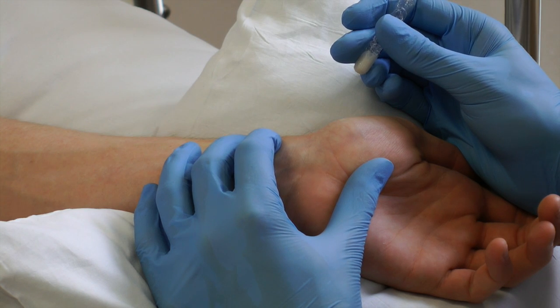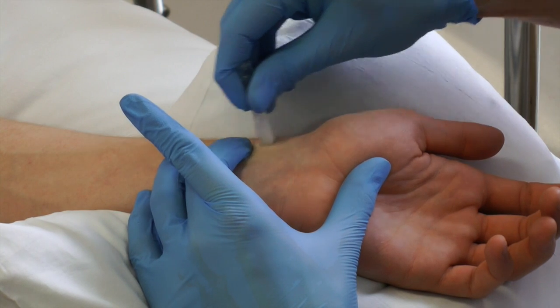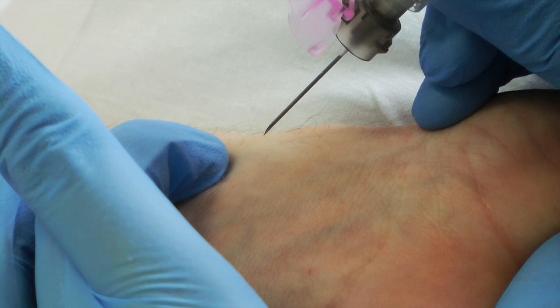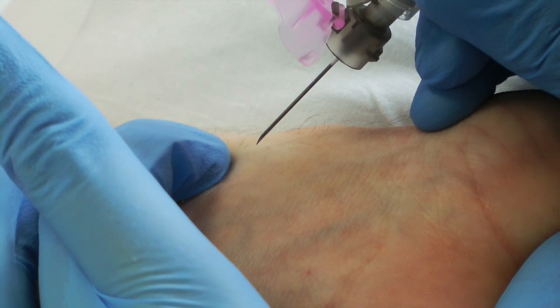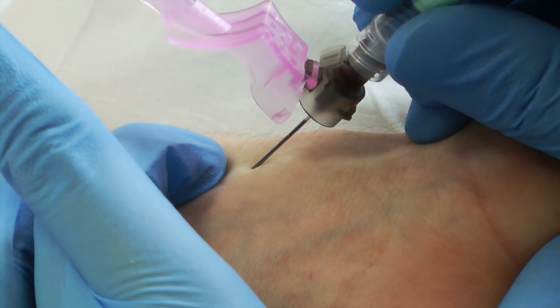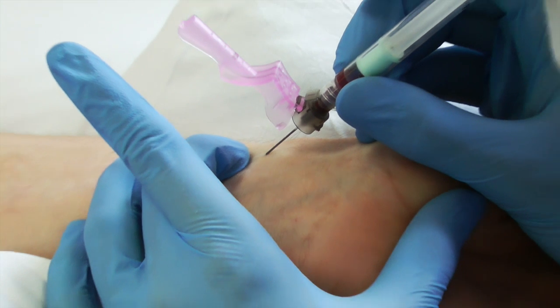When you are ready, lift the index finger. Re-clean the area to maintain sterility. Hold the syringe as if it is a pen. Warn the patient of a sharp scratch. Insert the needle at a 45 degree angle and note the flashback of arterial blood.